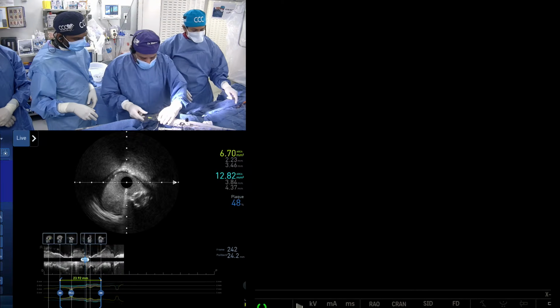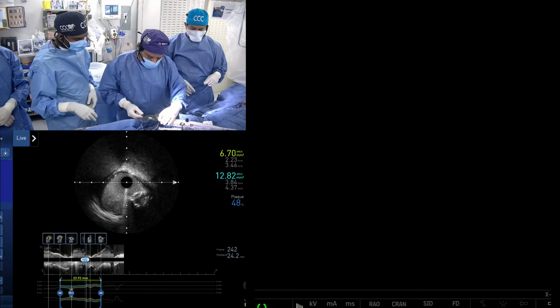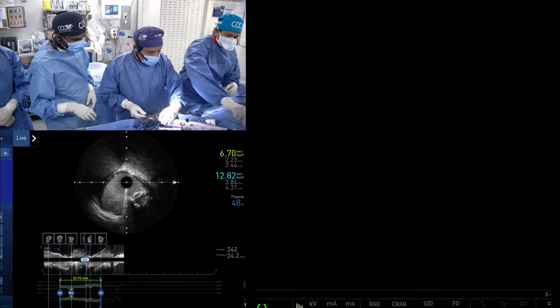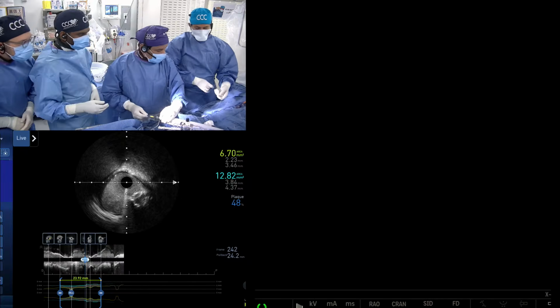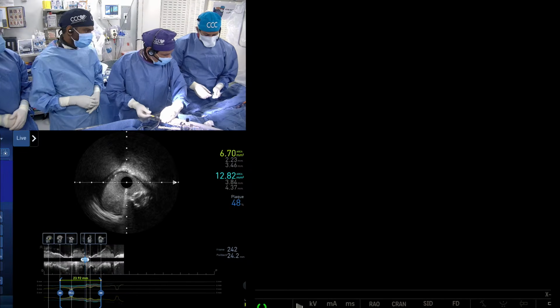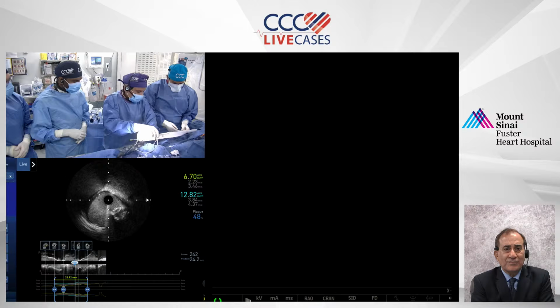It will not come out from the end. Oh, you mean there is some junk? What you're showing is what you have experienced doing cases overseas, where you have to be creative.